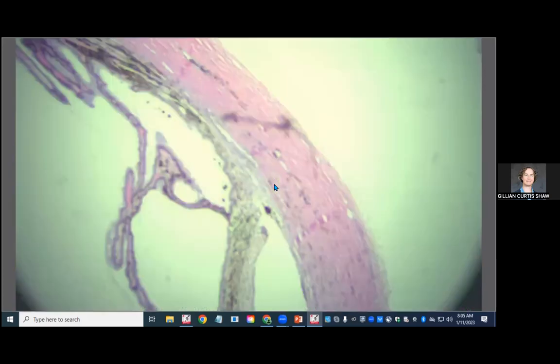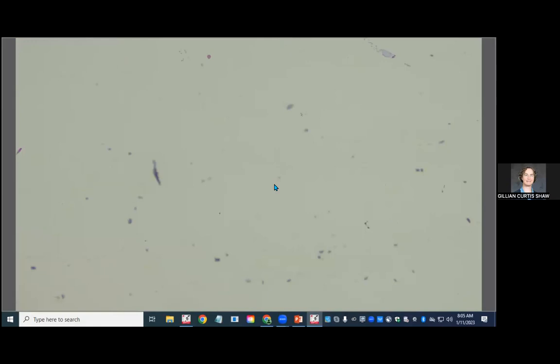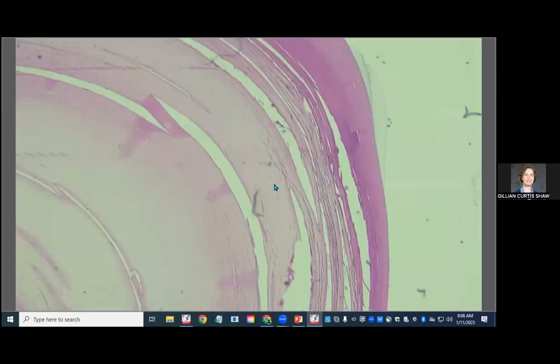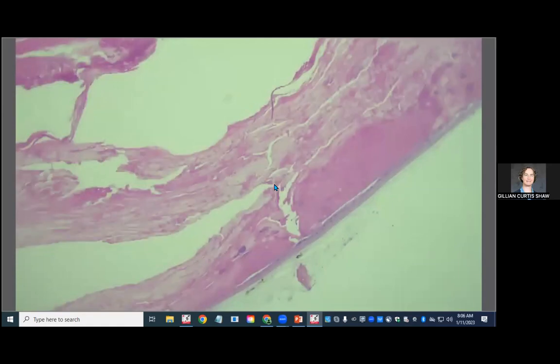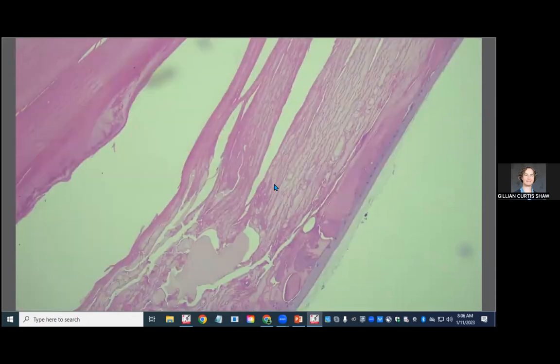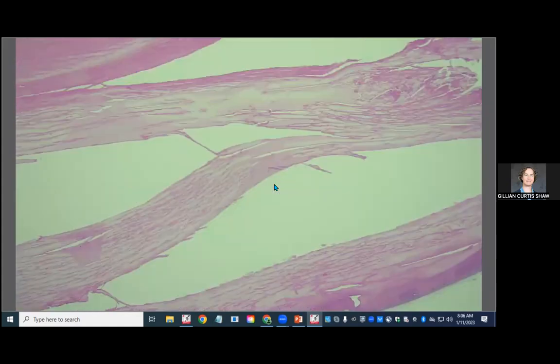And so they describe lens subluxation. And we want an explanation for that. Sometimes it's nice to be able to explain it with a cataract. In this case, there really is no cataract. The lens looks really, really good. There is a little bit of posterior migration of the lens epithelium and a little bit of degeneration and liquefaction of posterior lens fibers, but it's only on the posterior aspect of the lens. So in terms of cataracts, this is relatively unimpressive.